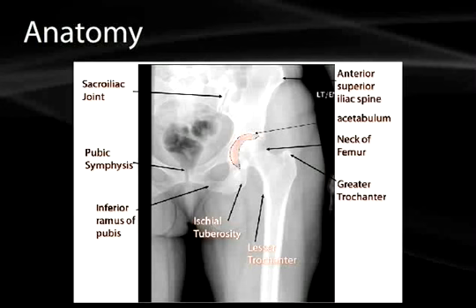You can see a nice pubic symphysis — remember this is going to be a fibrous cartilage band in between. Notice how the pelvic brim is easily visible; follow around the edge of the pelvic brim and make sure it's smooth. Look for differences between the left and right side of the os coxae as they attach there. You can see the inferior pubic ramus, where the genitalia and perineal membrane will come across, and the ischial tuberosity projecting posteriorly.